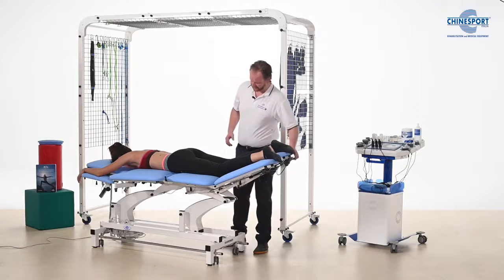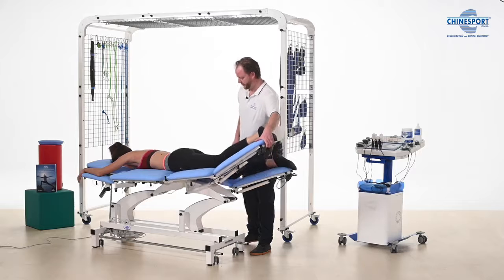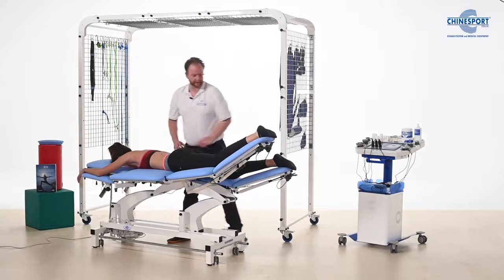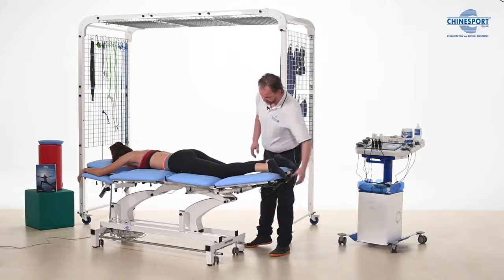If in some cases we want to add some rotation, then we can add that little bit of rotation here by just working with the leg segments, and we add some rotation. At some point we may want to go into extension.